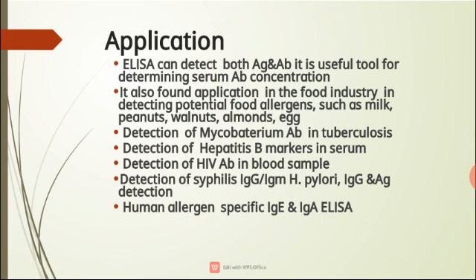Used for detection of Hepatitis B marker in serum. Used for detection of enterotoxin of E. coli in fishes. Detection of HIV antibodies in blood samples. Detection of syphilis IgG or IgM, H. pylori IgG and antigen detection. Human allergen specific IgE and IgA ELISA.